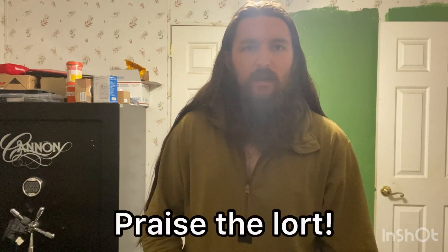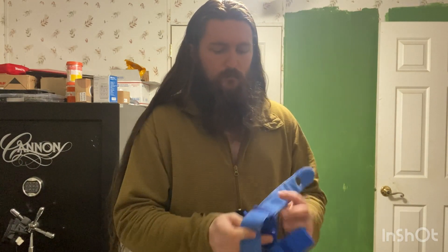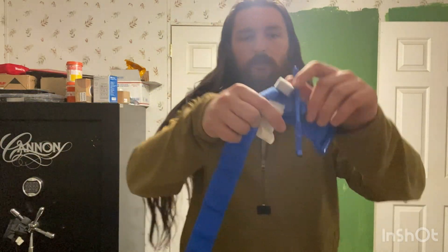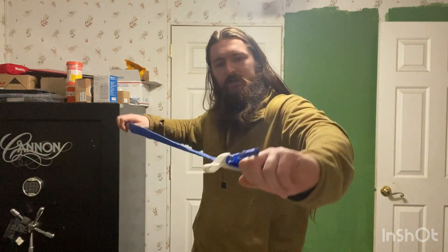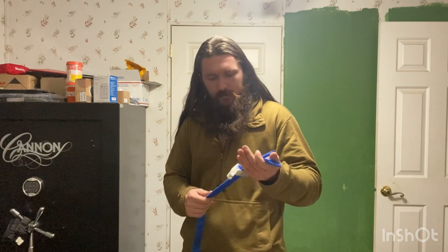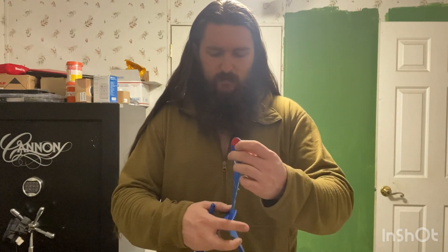So I put a tourniquet on and I have not lost my limb. I can assure you I do not have nerve damage — I've had tourniquets applied a lot and I'm all good. Before you put your tourniquet back, when you go to restage it, make sure to stretch it back out. The windlass will be all twisted up, so untwist it, and you'll see there's a lot of slack — pull that slack back out. That ensures you're starting from the correct place the next time this tourniquet goes on someone.